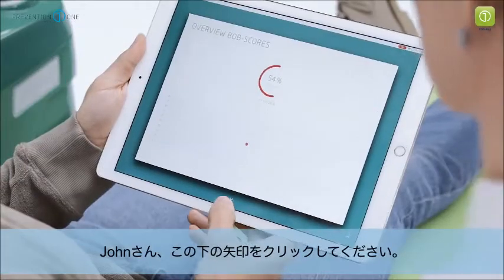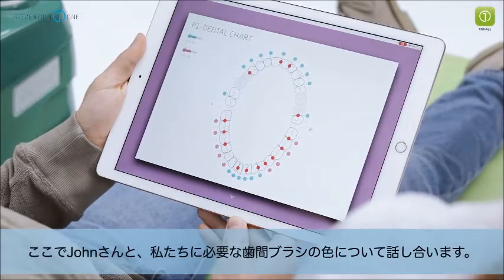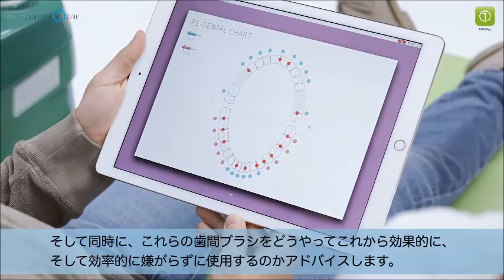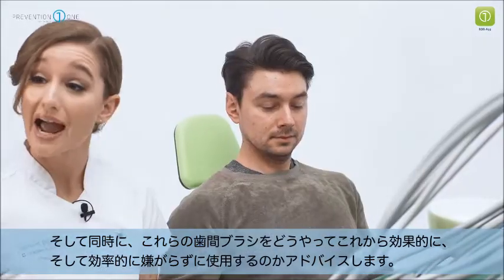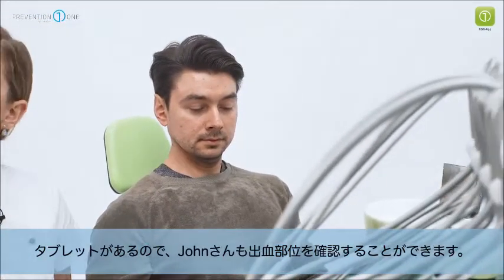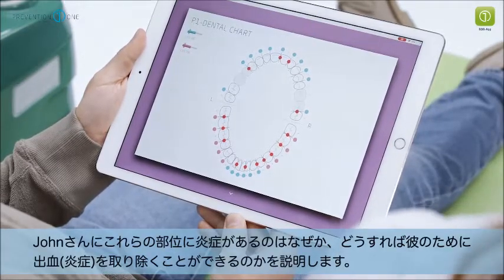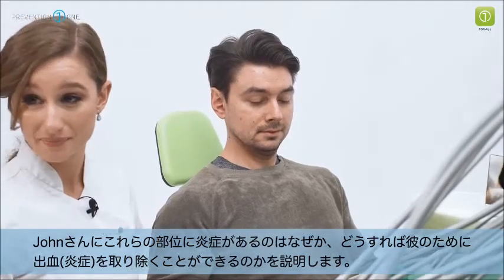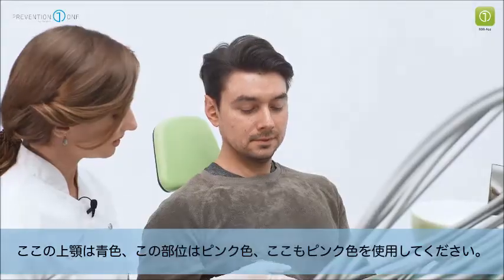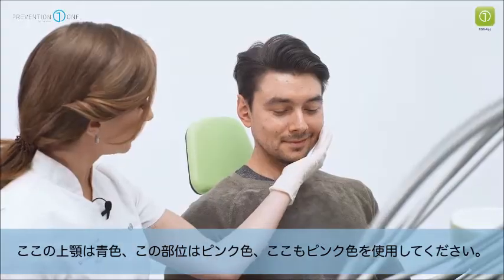By clicking the little brush button we can now discuss the colour of interdental brushes John needs to use. I may also do a coaching session to show John how to use those brushes effectively, efficiently and atraumatically. John is able to view the bleeding areas so I can explain why he has inflammation and how we can eliminate it. So John, you have bleeding here on your top teeth, and the colours you need are turquoise, pink here and pink here.